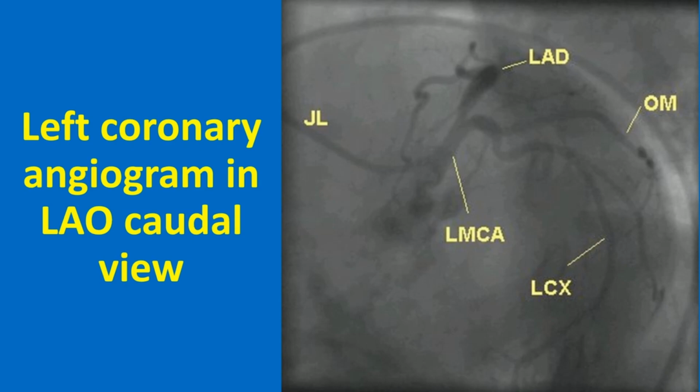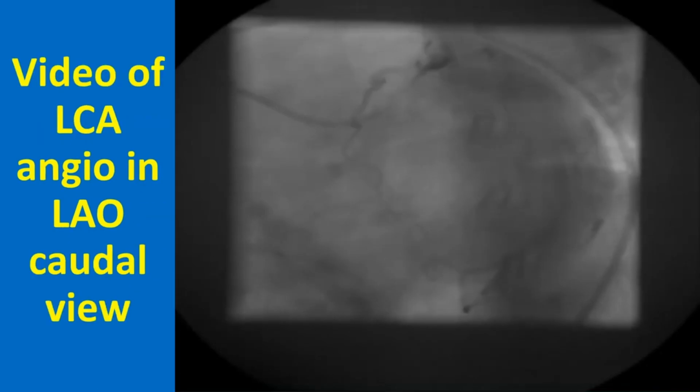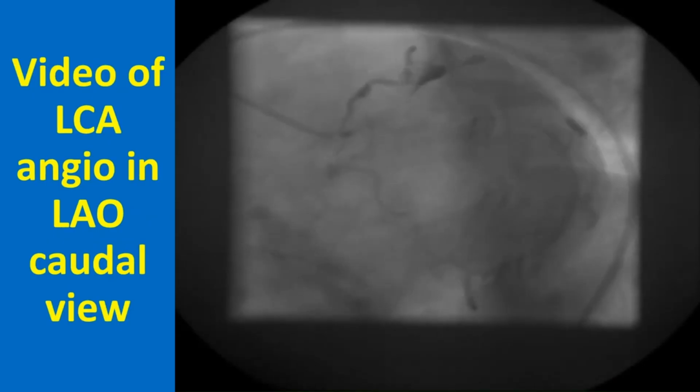In this view, mid-segment of LAD is foreshortened and hence this view should not be used during angioplasty of mid-LAD. But proximal region of LAD is visualized well. Proximal and mid segments of LCX are well seen in this view. Video of left coronary angiogram in LAO-caudal view is shown here with annotation of branches in a still frame.